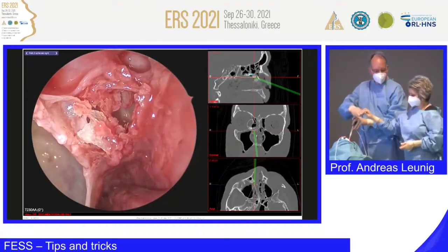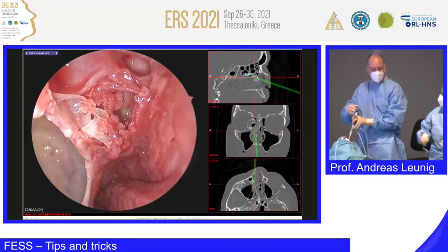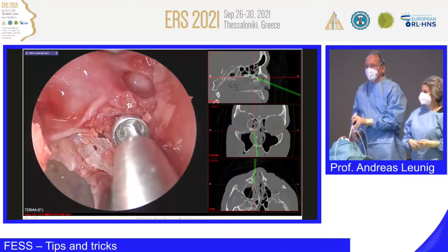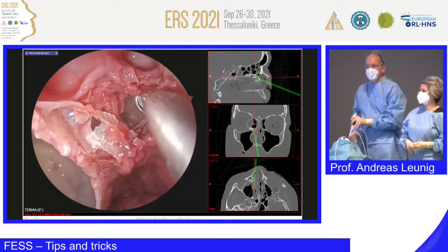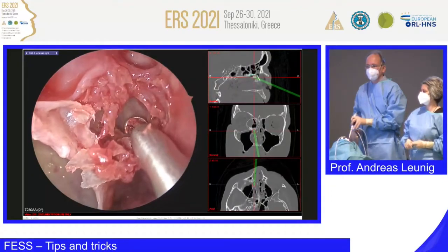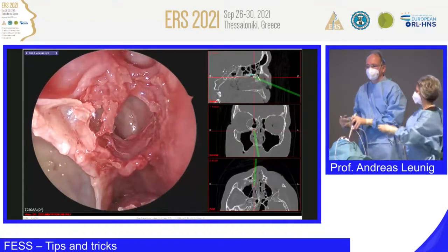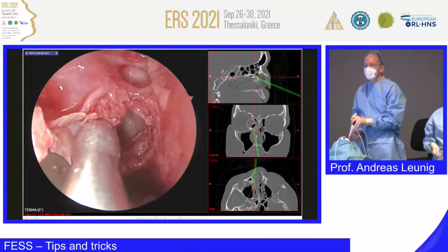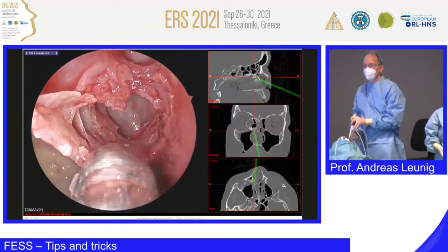Now we are trying to open the posterior ethmoid. For these instruments, I love them, but you have to clean them, otherwise you can break this punch because the pressure is getting too high when there's too much inside. I try to make it very gently, not tearing, just punching it away.